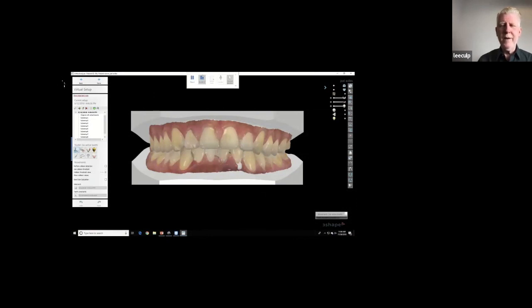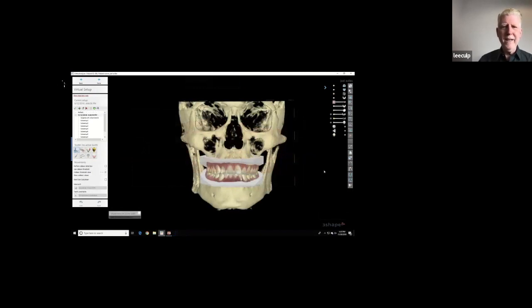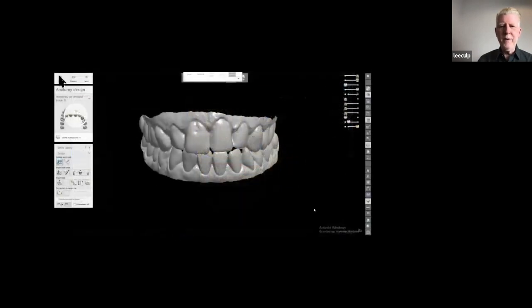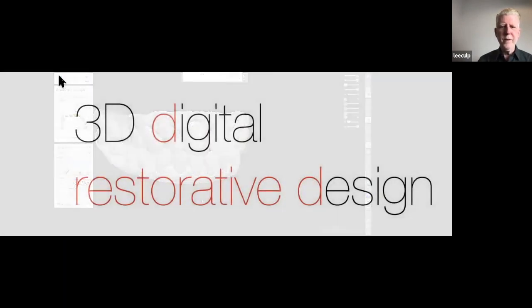And I am covered under FDA to be able to do that. But I cannot make an orthodontic tooth movement vacuum form guide. You can as a dentist. I cannot as a technician. That's a more complex FDA area that costs a lot to get into. So I can do surgery, but I can't move teeth. It's kind of interesting. But all this data together allows us to really have what we need to do any type of diagnostic for our patients, whether it's dentures or anything else.